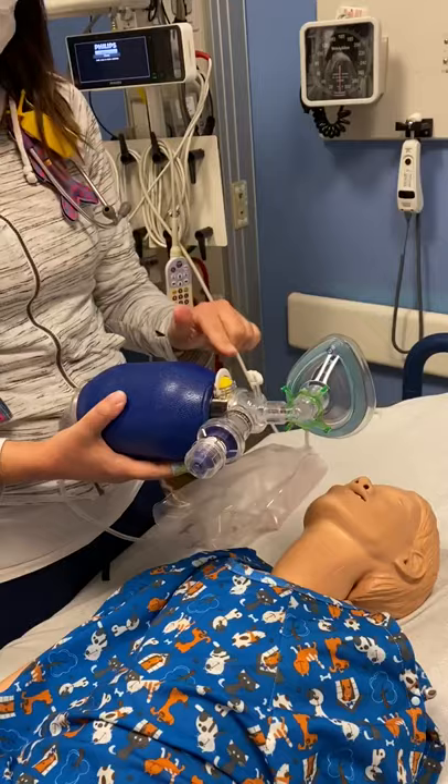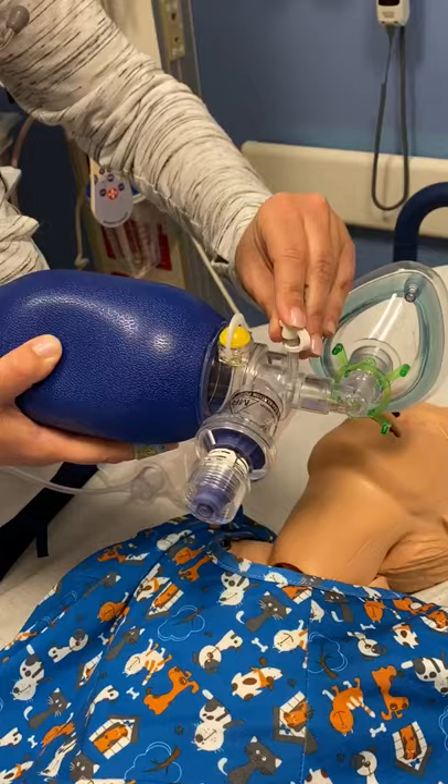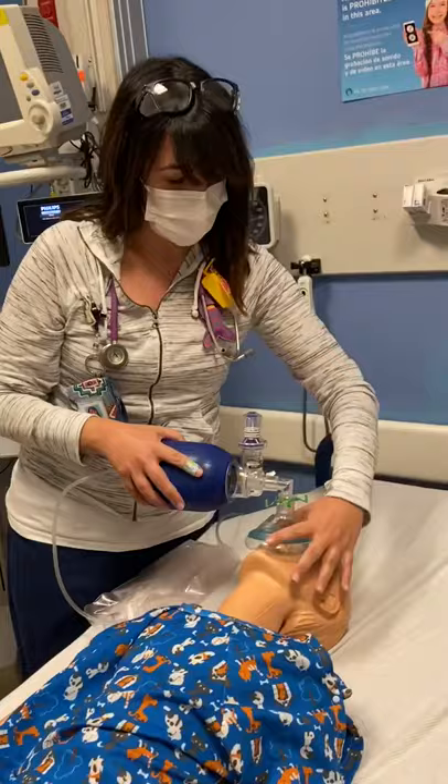This is for a manometer — you'll want to attach a manometer here. If you're not going to attach one, please make sure it's closed since it's a closed system. The most important thing about the BVM is to make sure you have a tight seal.